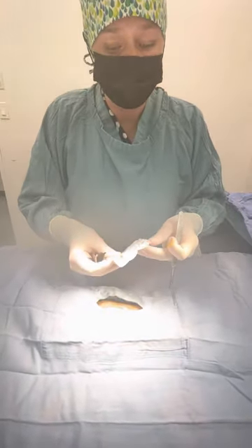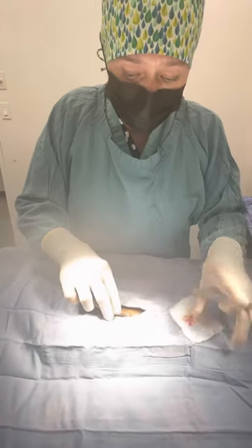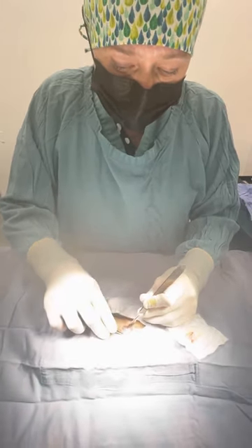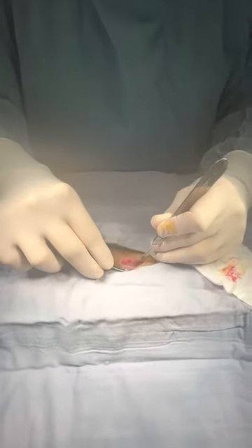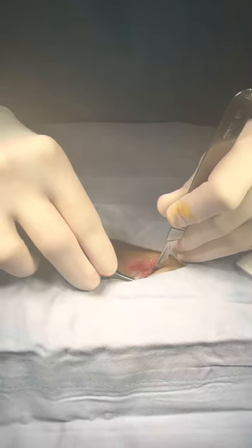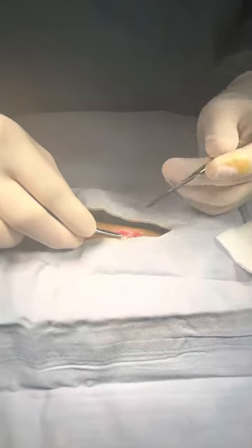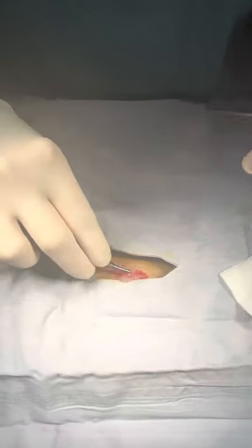We use gauze a fair amount both to control bleeding as well as to have better visibility and keep the surgical site dry. I don't know if you can see this, but there is a white line running here that's called the linea alba. The linea alba is where the rectus abdominis muscles — the six-pack muscles you might call them — come together, and that's where we make our incision to gain access into the abdomen.